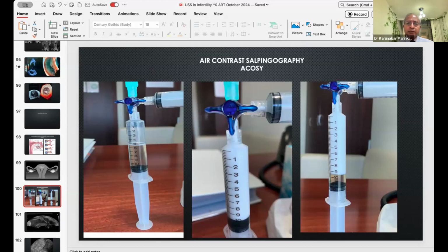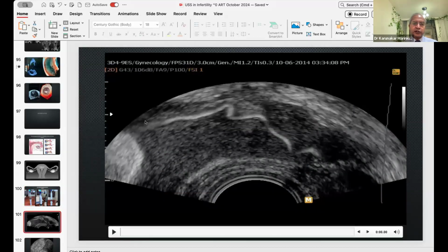This is the only thing that I'm using, because I know sperm-friendly sperm wash media has a high albumin content. So I did a lot of homework in my kitchen to find out that when I'm whipping egg white, I found a lot of froth. So I thought I'll use it. Because it's sperm wash media, it contains albumin. I take 5 ml albumin, which is called sperm wash media. I take 5 ml air, take a 3-way connection, and then agitate them. Just mix them 100 times. You get froth, then you inject the froth with the HSG cannula into the uterus.